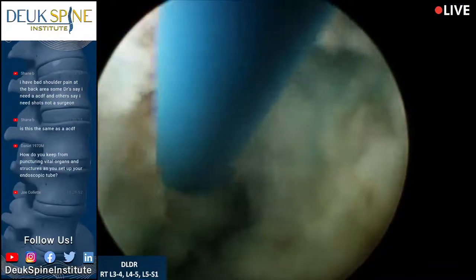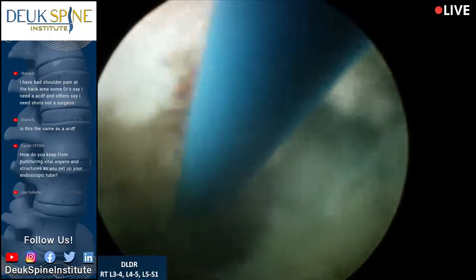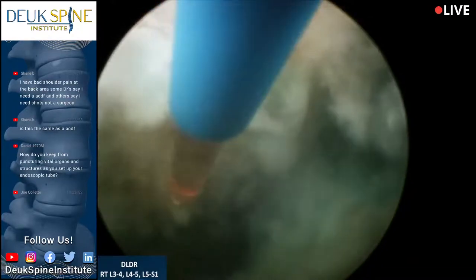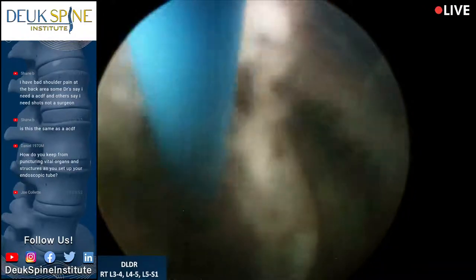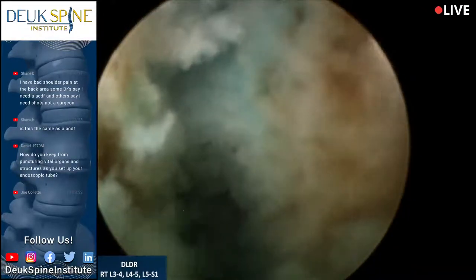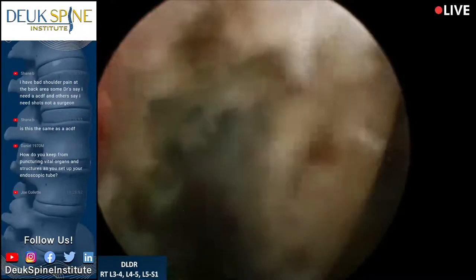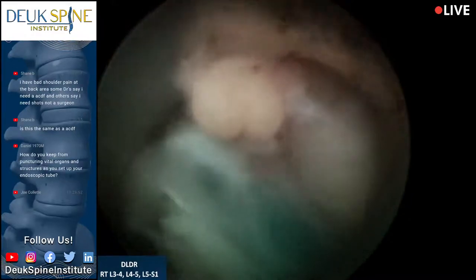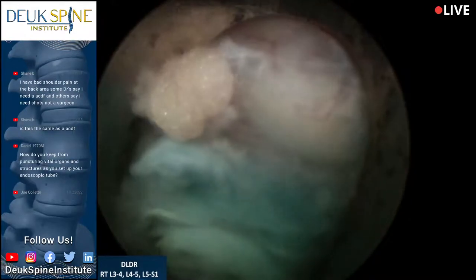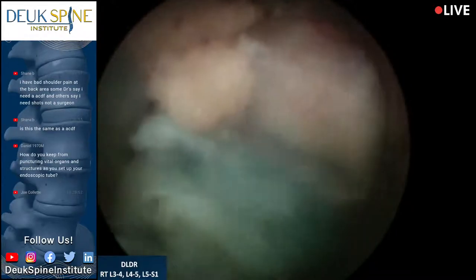We're going to be done in a second here, and I'll show you the incision on this patient. It's only 7 millimeters. Once again, we fixed 3 discs with this tiny incision. And let's see if we can find the nerve root again. Well, see this time, okay, there it is. You guys see that? That white thing right there? It has the veins and arteries on it. See, it's next to the fat. That is the nerve root.